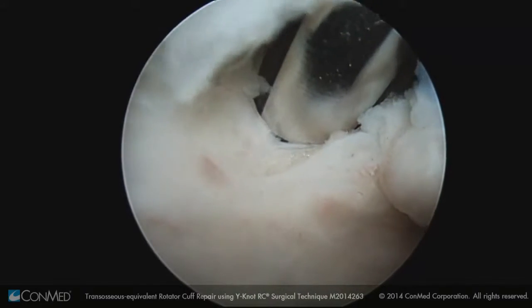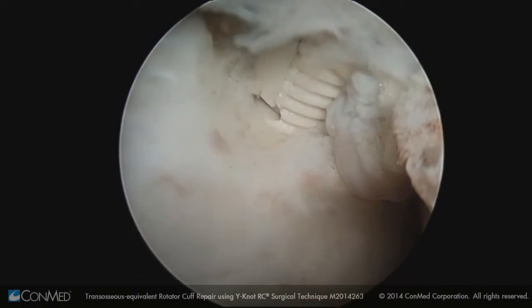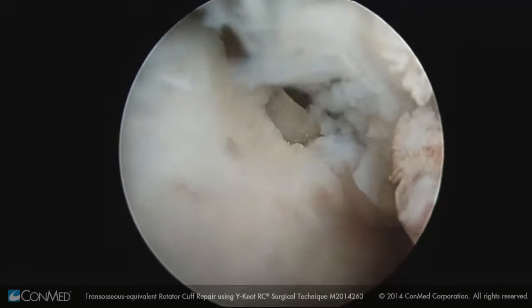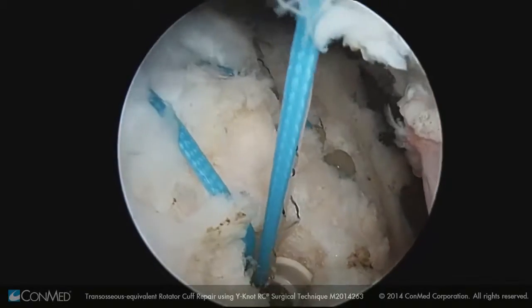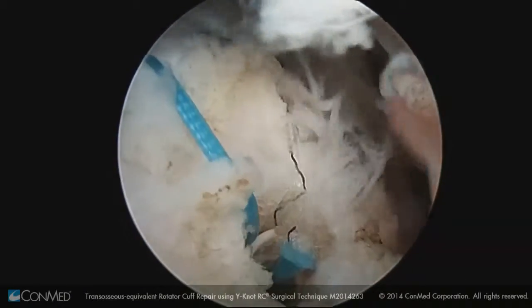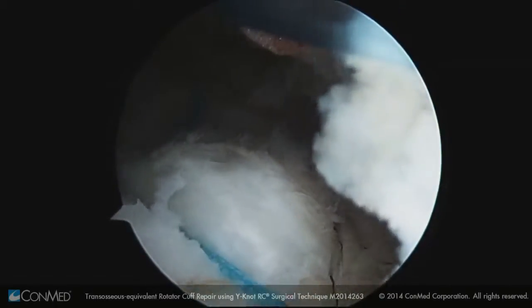Here we're placing our more posterior of the two 4.5 millimeter pop lock anchors. Here we have, again, in standard fashion, passed the two tails of the suture through the pop lock anchor and then inserted it, fired the locking mechanism, and cut the suture tails flush with the cortex.